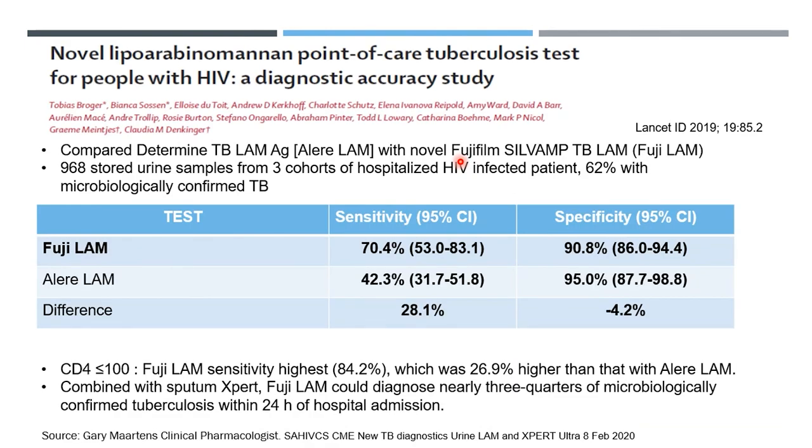So very exciting. It's not yet in use. It's been utilized in clinical research settings. There's this novel LAM point of care test, which was used from cohorts of patients that had been hospitalized within Cape Town, and they compared what we have now, which is the Alere LAM, with this novel Fujifilm LAM point of care test. They looked at 968 stored samples. 62% of those patients had been confirmed as having TB.